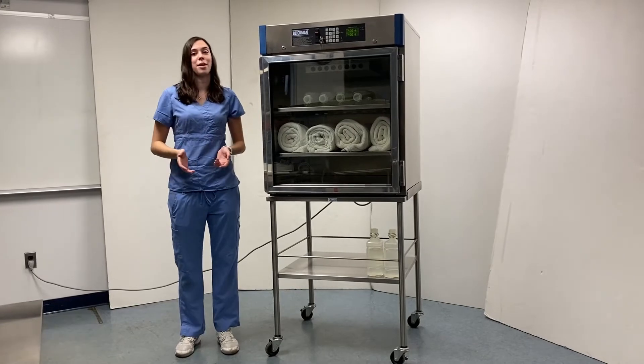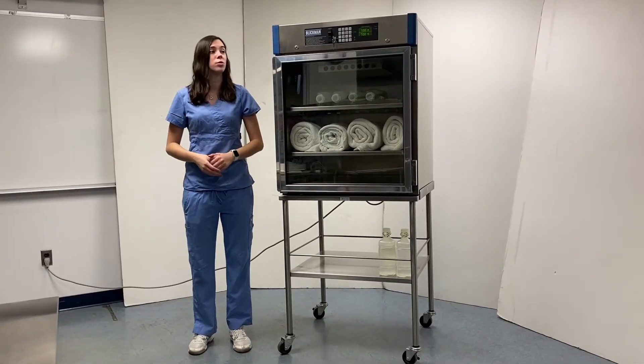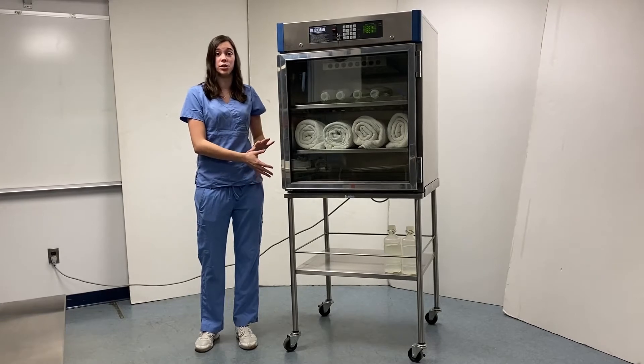This is a video on Blickman's warming cabinets. Today we'll be talking about a 7922TG model, which is the largest of three tabletop warming cabinets we offer. This warming cabinet can also be placed under counter if you so desire.